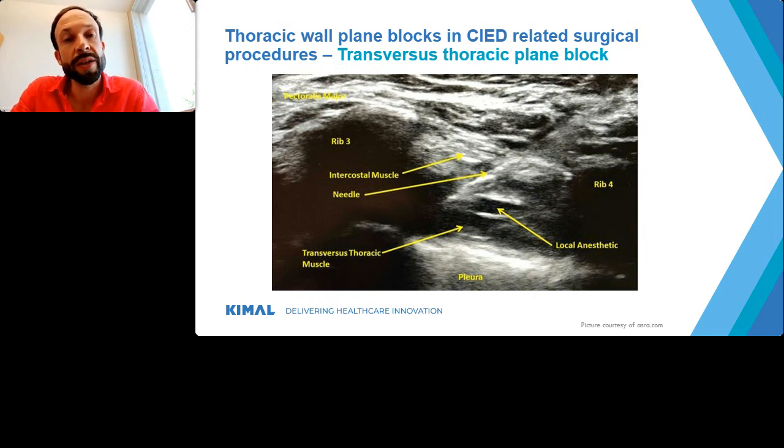And therefore I suggest you use this kind of local anesthesia. As you can see below, this is indicated as the pleura, so again you want to cover the whole procedure with your ultrasound probe to be safe and secure.